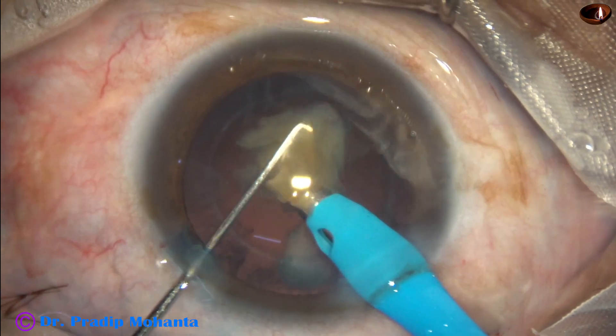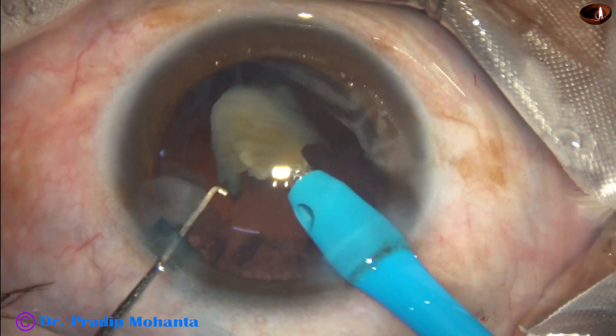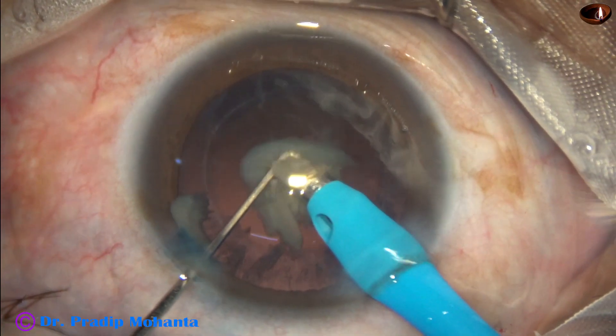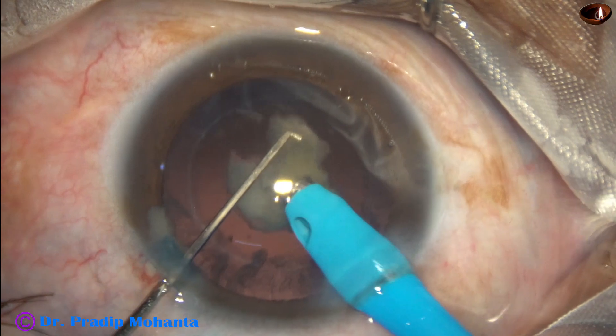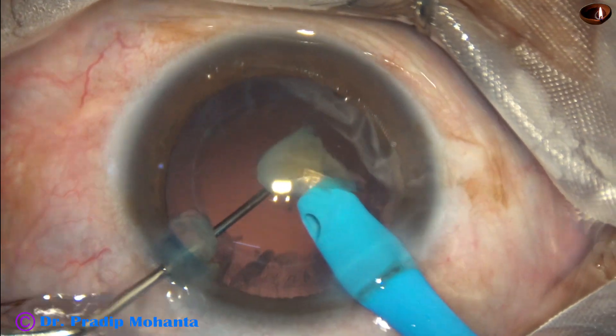Very carefully, keeping an eye on the posterior capsule, I emulsify this space. At this time the vacuum is only 90 millimeters of mercury and flow rate is 20.